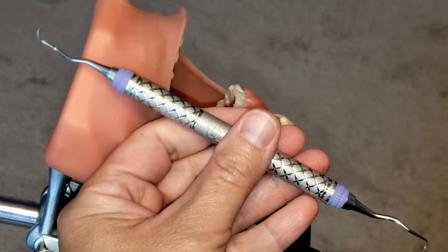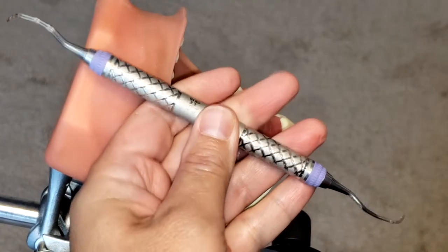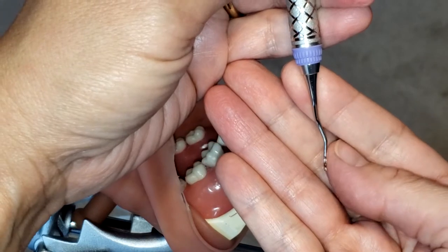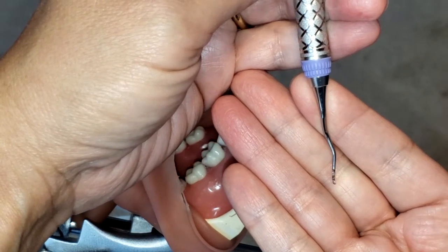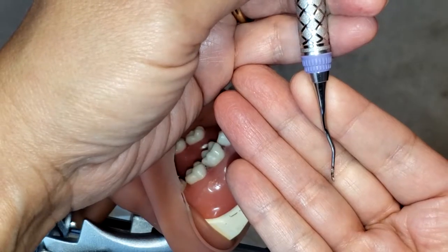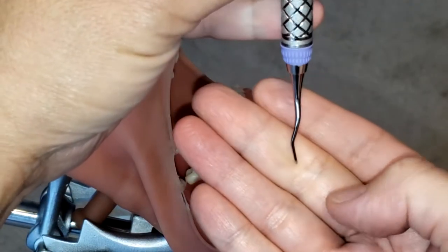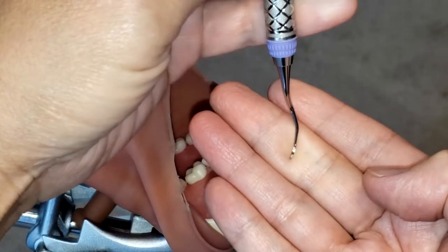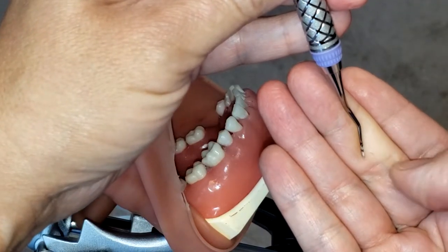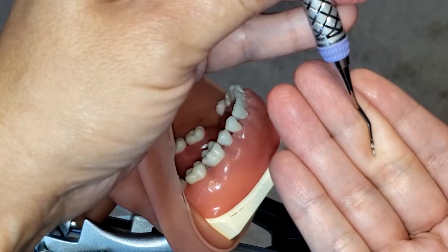It is a periodontal instrument so it is to be used subgingivally, and again this is a curette so it has one cutting edge. If you take a closer look you see that the face tilts at approximately a 70 degree angle to the lower shank, which helps to identify the cutting edge. Also because it is curved, it has a rounded toe and a rounded back — the cutting edges and rounded toe enhance adaptation to rounded root surfaces, root concavities, and furcation areas.